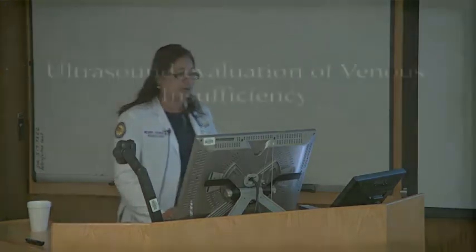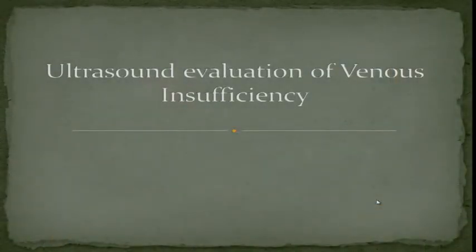All right, today I'll talk about the ultrasound evaluation of venous insufficiency. I've got some text slides, some image slides, and I've got 2 videos. So I'm hoping they will play and we'll go along with that. If there is a question, please ask me, and you can interrupt me at any time.